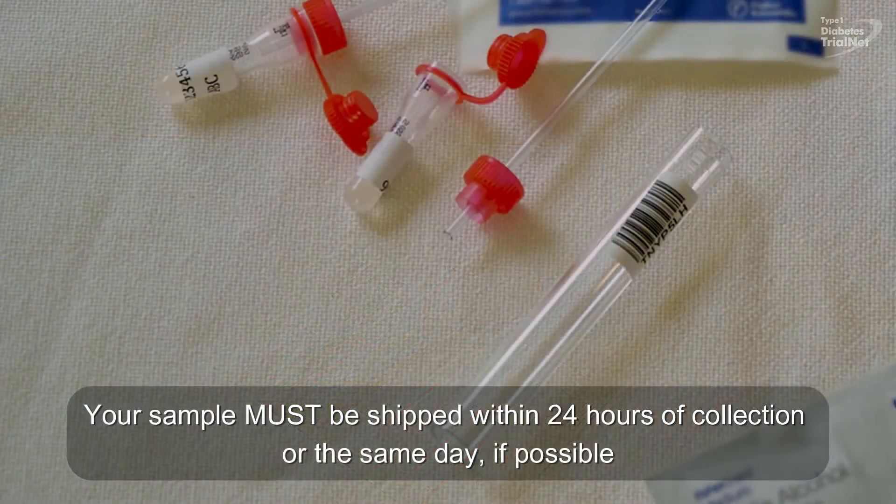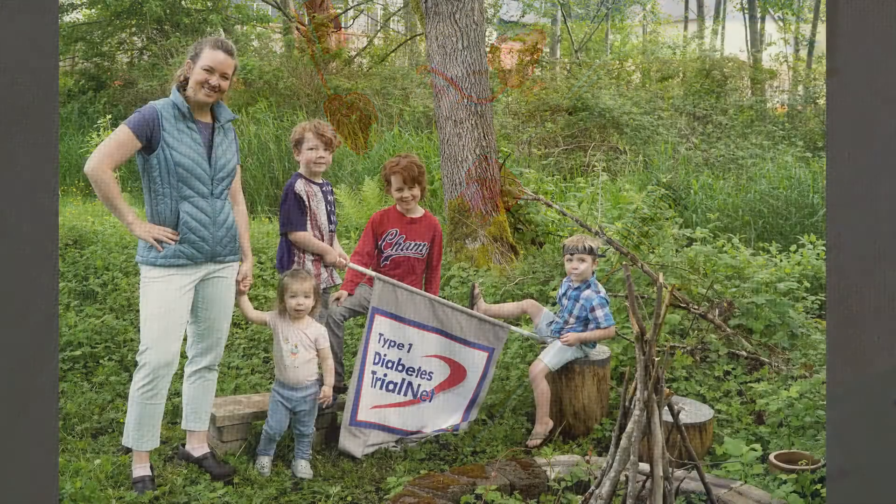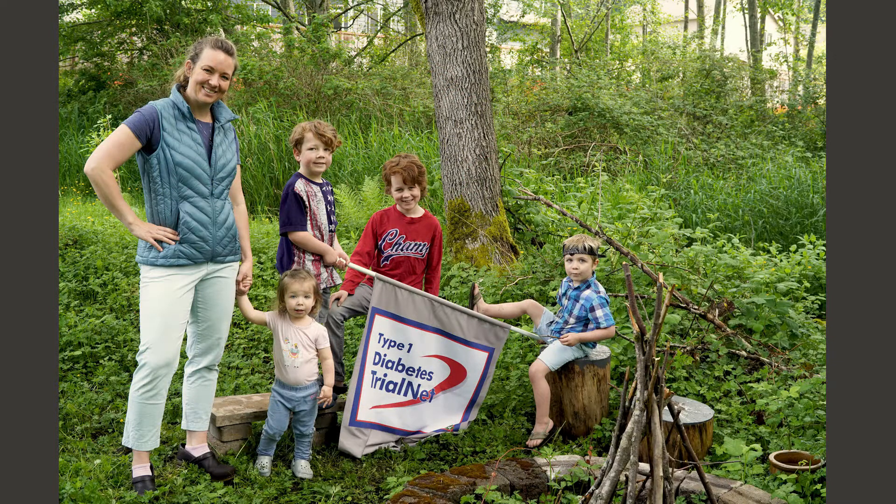Please be sure that the sample is collected by the individual addressed in the kit letter. Each tube is labeled with a barcode so our lab can verify who the sample belongs to. If completing kits for multiple family members, please be sure to complete one kit at a time to prevent materials from becoming switched between family members.